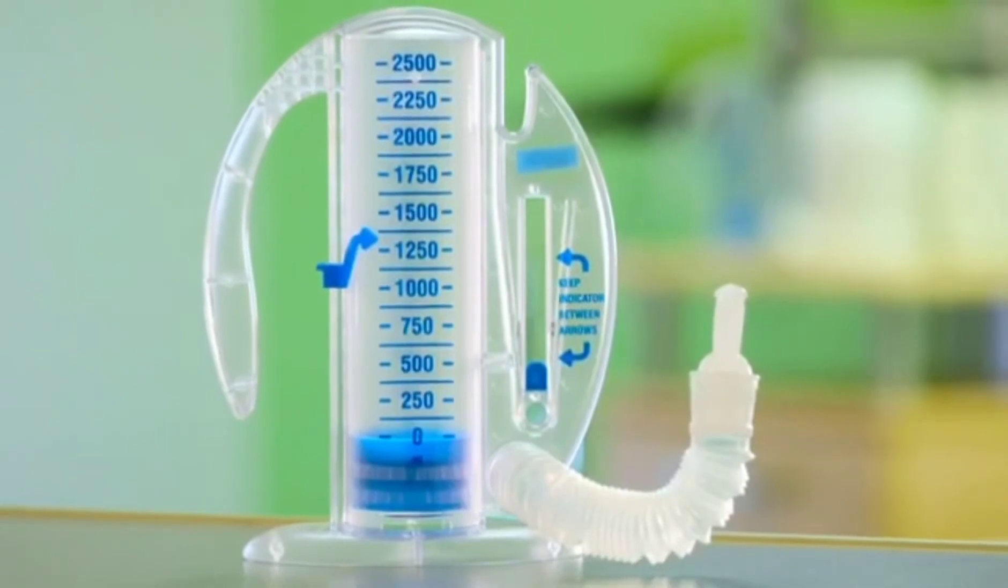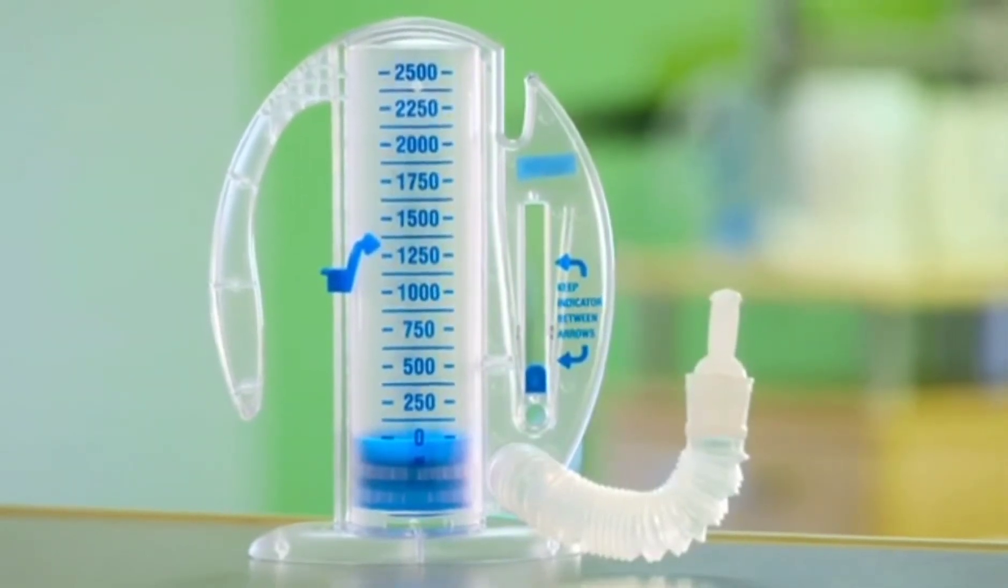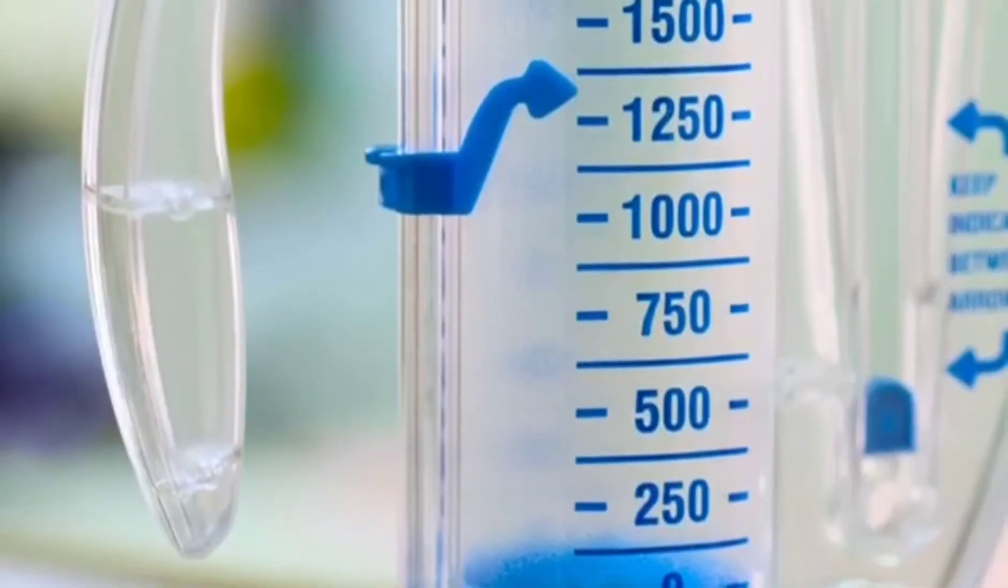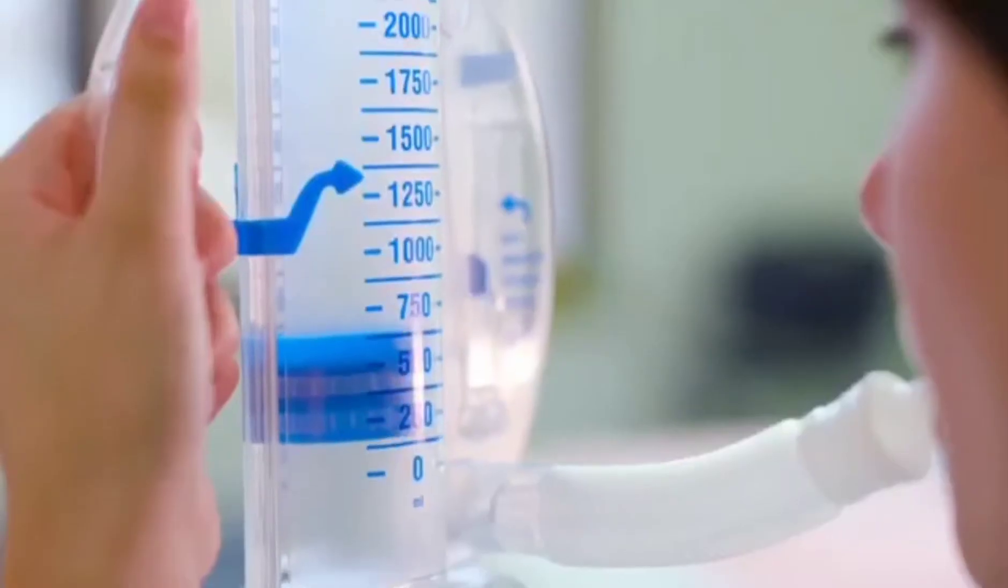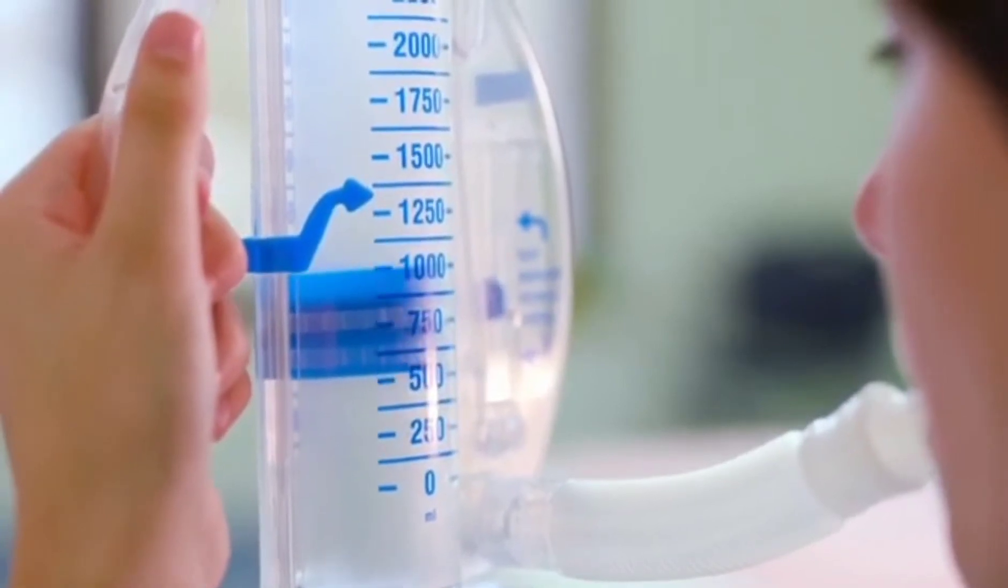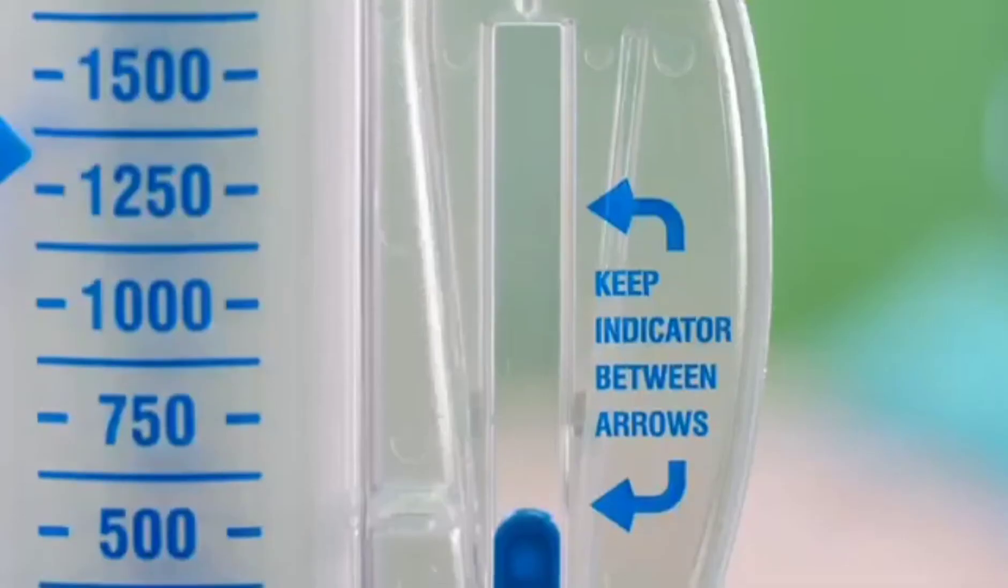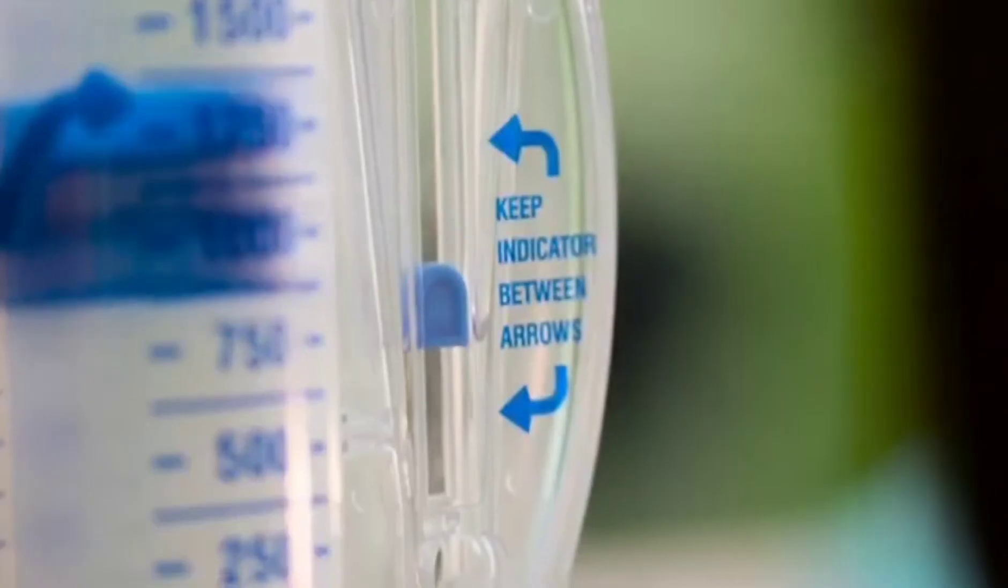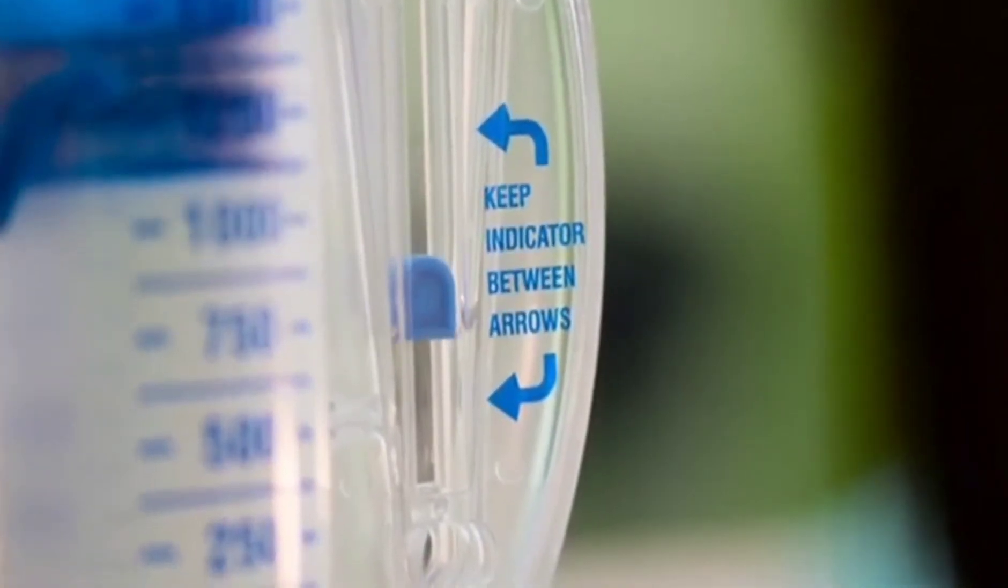An incentive spirometer is made of hollow, clear plastic. It has a tube with a mouthpiece attached. Numbers on the spirometer show how deeply you breathe in. A little disc called a piston moves up and down. The area with arrows or lines on it shows a range. A ball goes up and down in this range to show how slowly you breathe in.